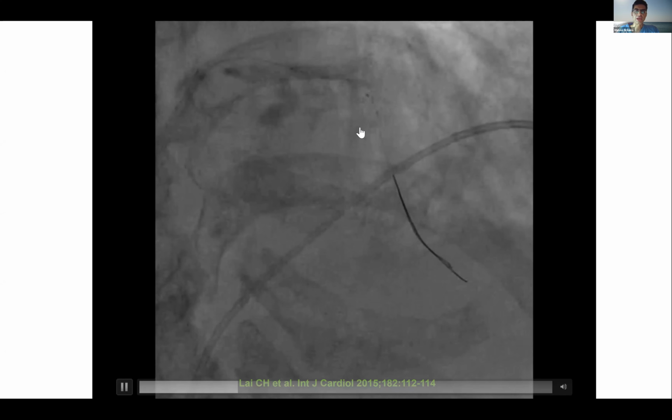Another way that Stefan is saying, which is another intriguing way, is to get a balloon out to the pericardium and kind of stop blocking it there in the meantime. But yes, this is one, a massive perforation, that you want to deal with as fast as you can.